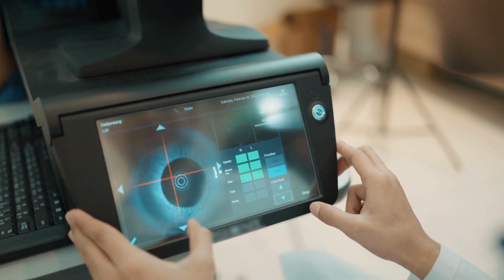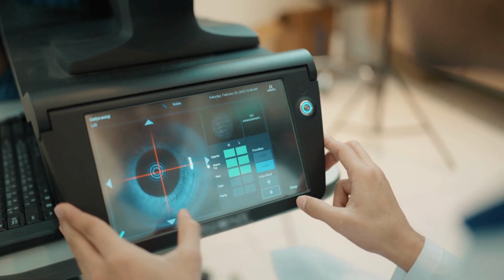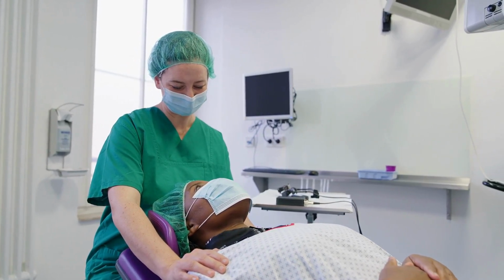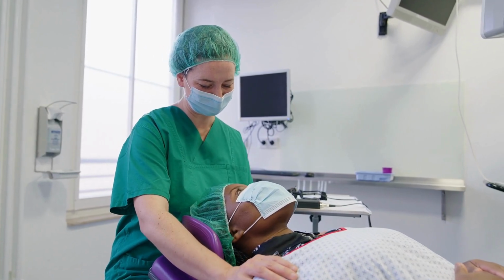In the surgery, an artificial intraocular lens replaces the removed cloudy lens, held in place by the lens's natural capsule. Despite artificial lenses not progressing to cataracts, individuals undergoing this surgery may experience a recurrence of blurred vision over time due to posterior capsule opacification.